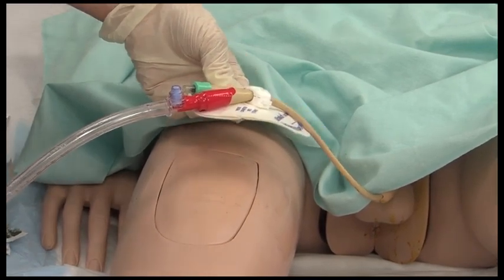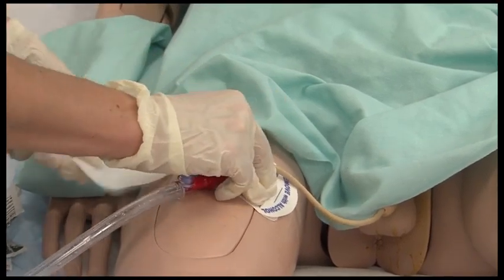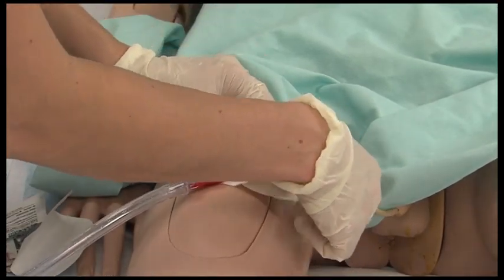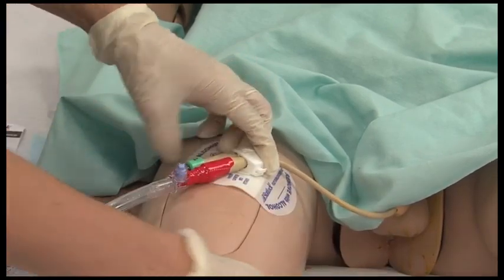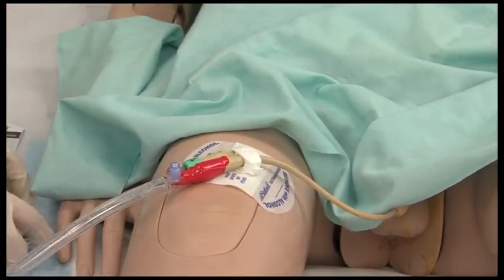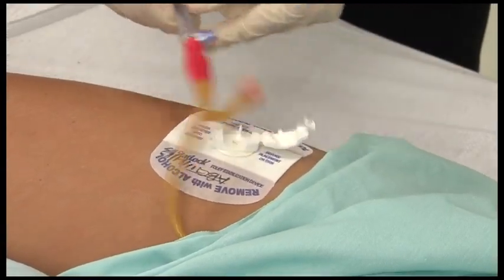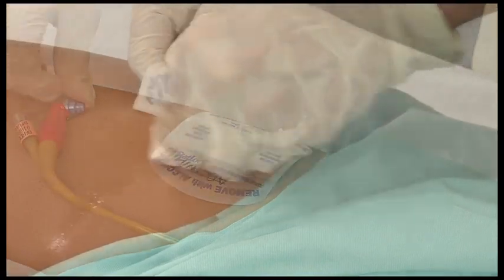Align the StatLock stabilization device over the securement site, leaving approximately 1 inch of catheter slack between the insertion site and the StatLock stabilization device retainer. While holding the retainer to keep the pad in place, peel away paper backing, one side at a time, and place tension-free on skin. To remove the StatLock stabilization device, open the retainer by pressing the release button with your thumb, then gently lift to open. Remove the Foley catheter.